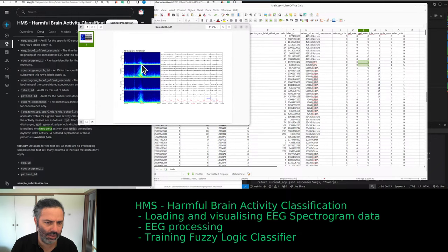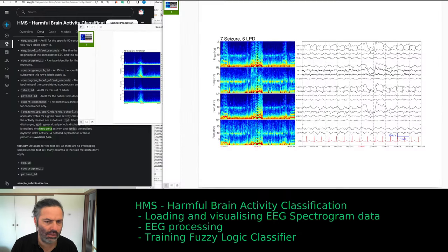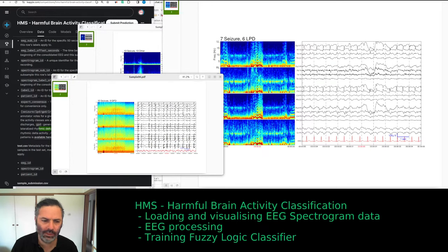There's no seizure in here. See what the GPD. So I don't get it. How there were 10 seizures labeled and now 9 GPDs in the same 10 minutes worth of recording. Yeah, it looks like there's something happening there in the spectrogram, but it's not visible in the raw data. The ECG is a total mess.